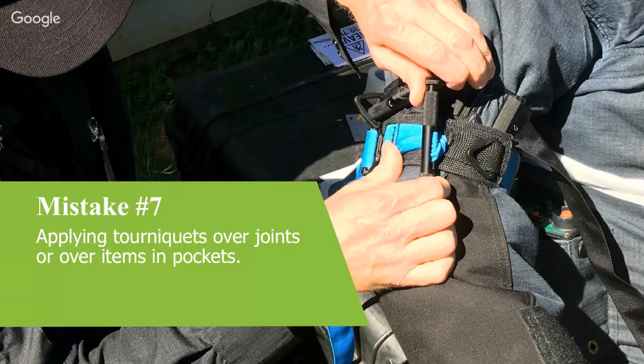Just touching really quickly on some of the questions before we move on, or comments. Phil has noted that first responders with St John Ambulance don't spend any time teaching tourniquets.